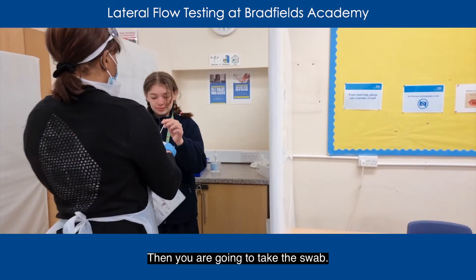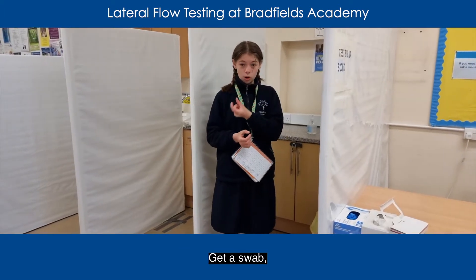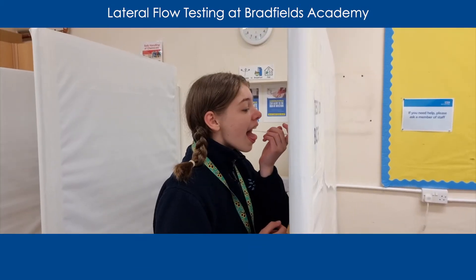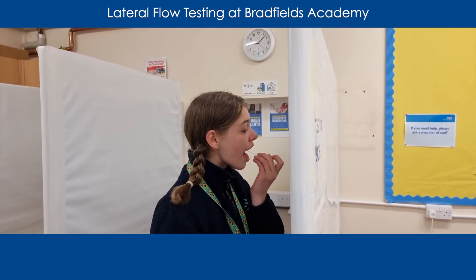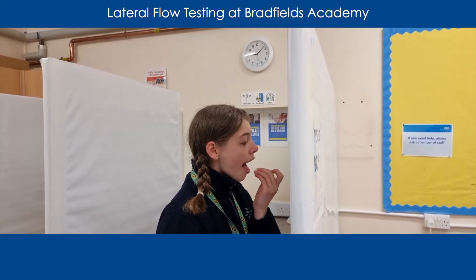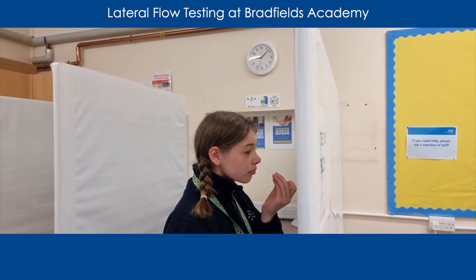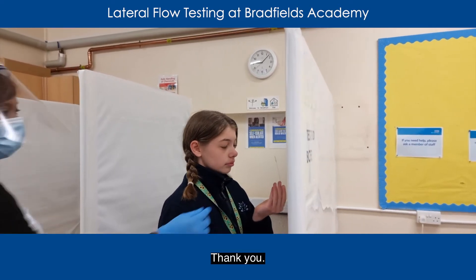Then you're going to take the swab. Get the swab and do your tonsils first and then your nose. And then you do your nostril. Excellent. Well done mate. Thank you.